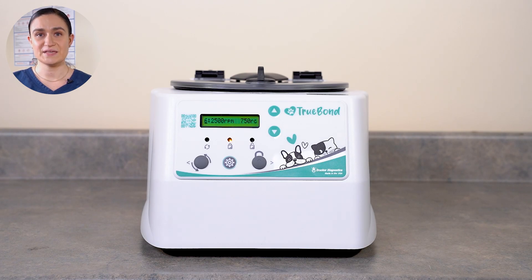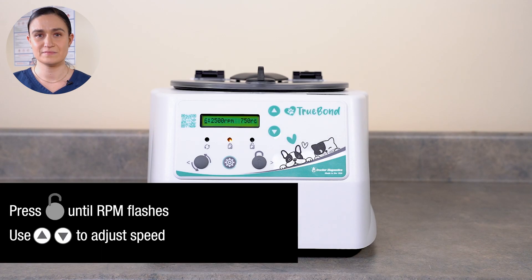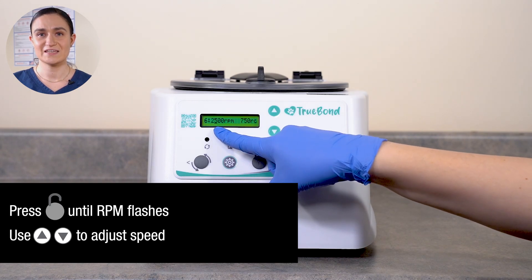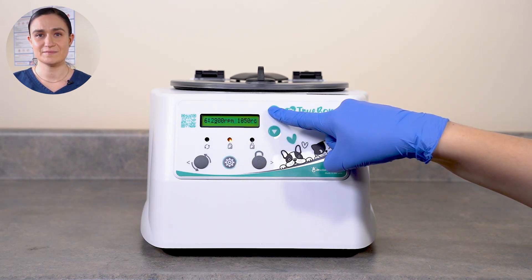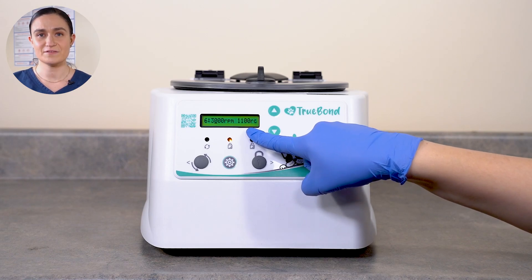We're going to start with the speed, which is the first setting shown when you enter this menu. Press Stop Unlock once. The number next to RPM should begin flashing, indicating that setting is currently selected. Use the up and down arrow buttons next to the screen to adjust the speed. The current value on the screen will update as you adjust. This screen also displays RCF, which is g-force, if you prefer to measure by g-force instead of RPM.